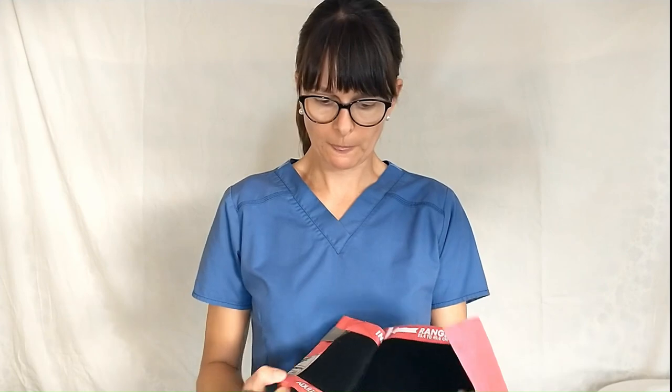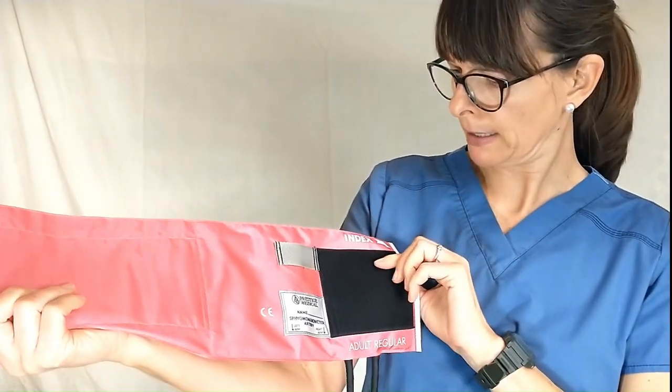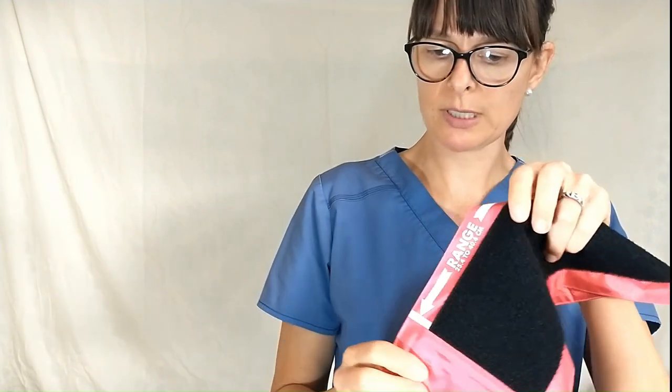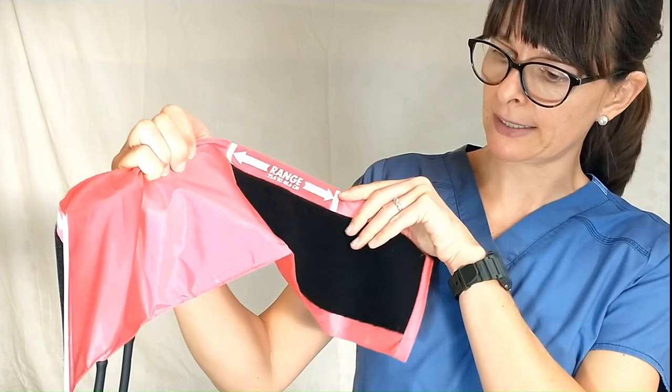Now if we take a look at this blood pressure cuff, it'll tell us over here that it's an adult regular size, and then over here it also has the range in centimeters, which in this particular case is 25.4 to 40.6 centimeters.